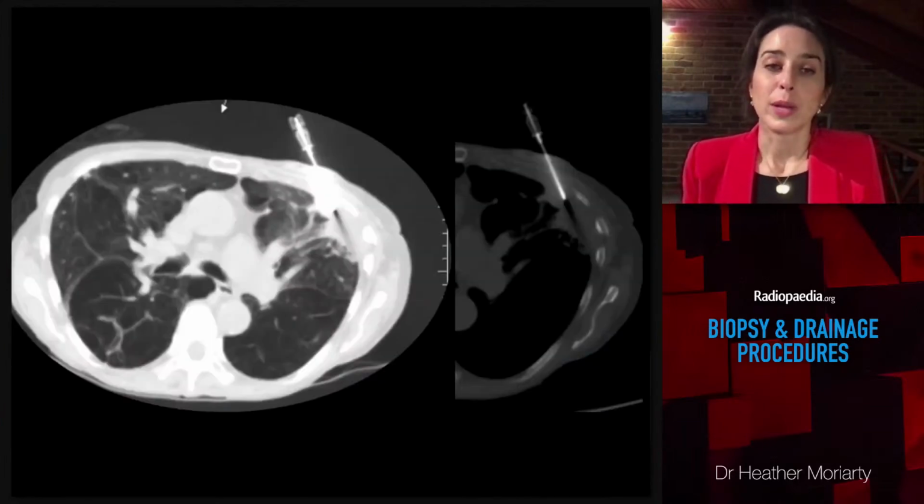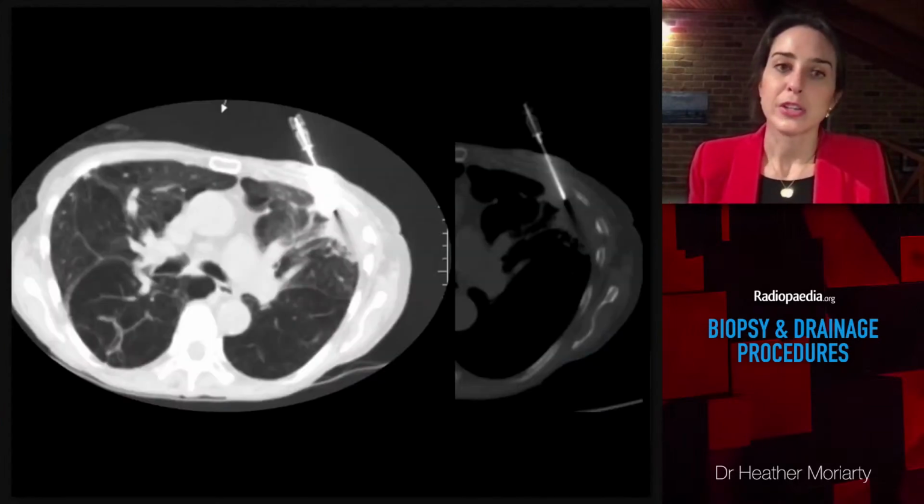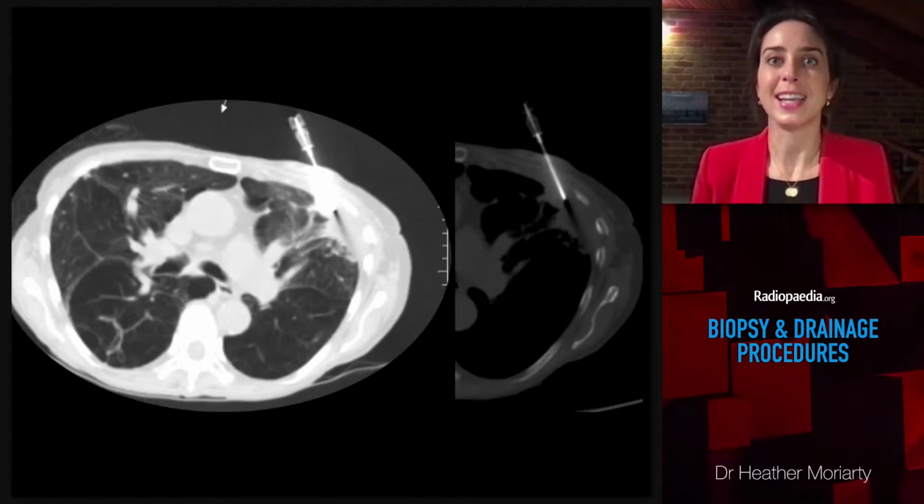It's important that when a patient can see parts of the procedure, for instance, a biopsy or drain for an anterior approach, you've described what they might see before the procedure. It can really help reduce anxiety during the procedure when there is, for instance, an 80 centimetre Amplatz wire coming out of their chest or whatever else.